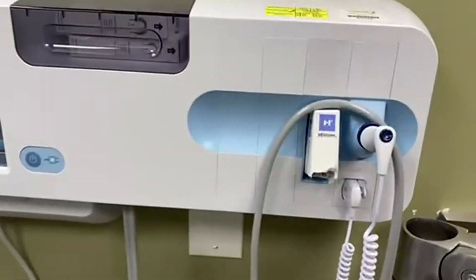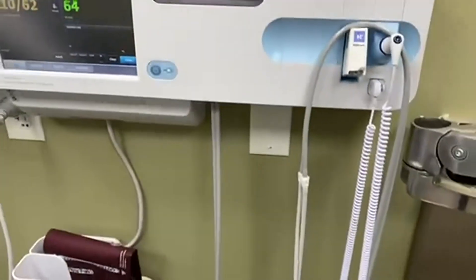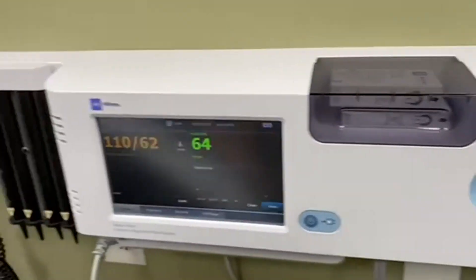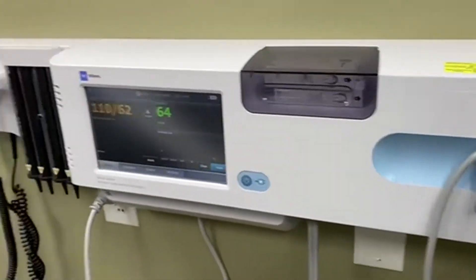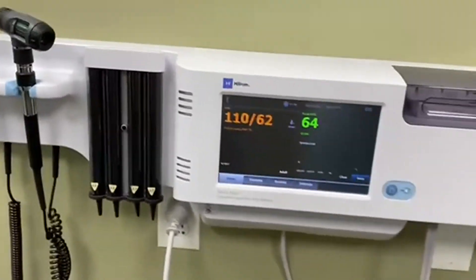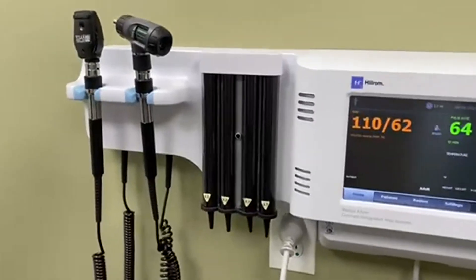Today we're going to be talking about the Welsh Allen Connects Wall System. This is in our doctor's office and it's just a really, really good looking system. Fully integrated, it has blood pressure monitors and temperatures — it really does lots and lots of things and keeps everything nice and handy for when you're working on a patient.